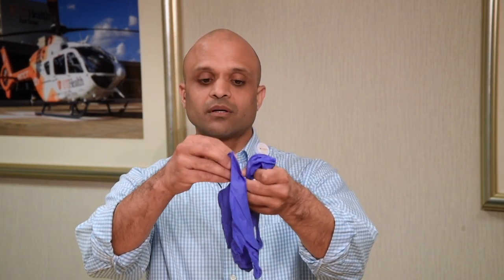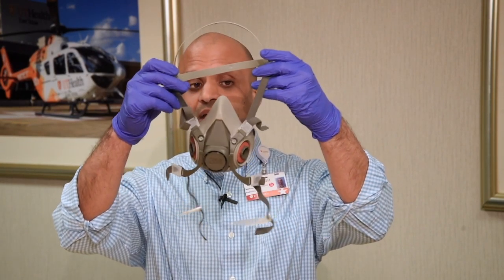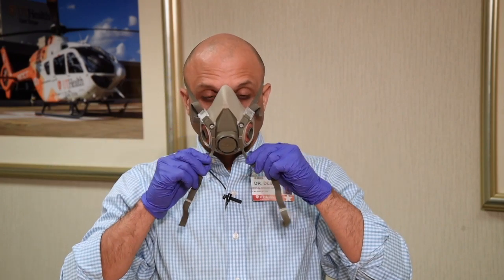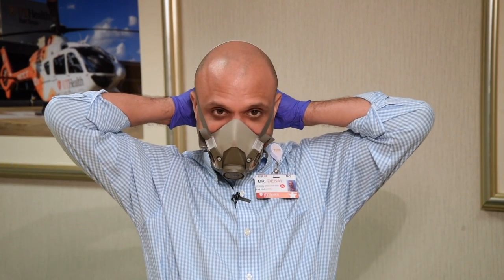The first thing you want to do before putting this mask on is always wear some clean gloves. Hopefully when you're donning it, it's after you've already disinfected it. So you're going to grab it and put the halo piece around your head, then adjust the neck straps to properly snap behind you. I have taken off the filter cartridges so you can actually hear me speak, but normally your filter cartridges would be on the sides of the mask.